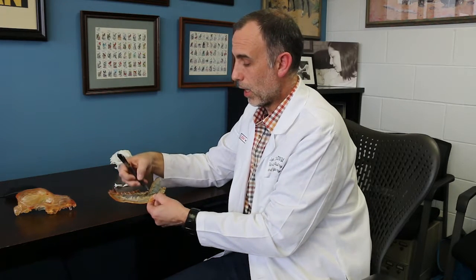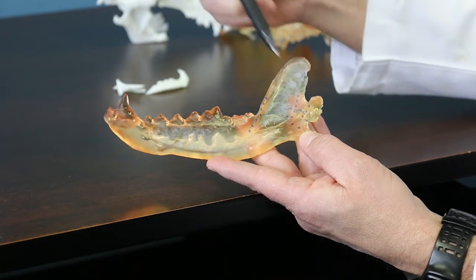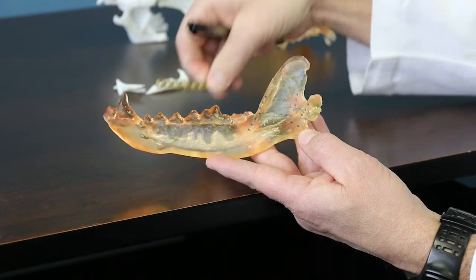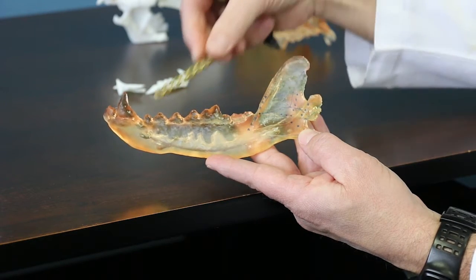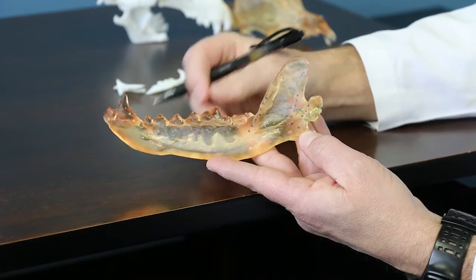And we can use this print, and by drawing the fracture lines on the print, we can then use the model to pre-contour some bone plates. By pre-contouring the bone plates, we have two advantages. One is that it speeds up the surgery time. Normally, the way this would be done is the bone plates would be contoured and matched to the bone in surgery, and that takes time. So by doing it ahead of time, we decrease the amount of time the patient's under anesthesia.